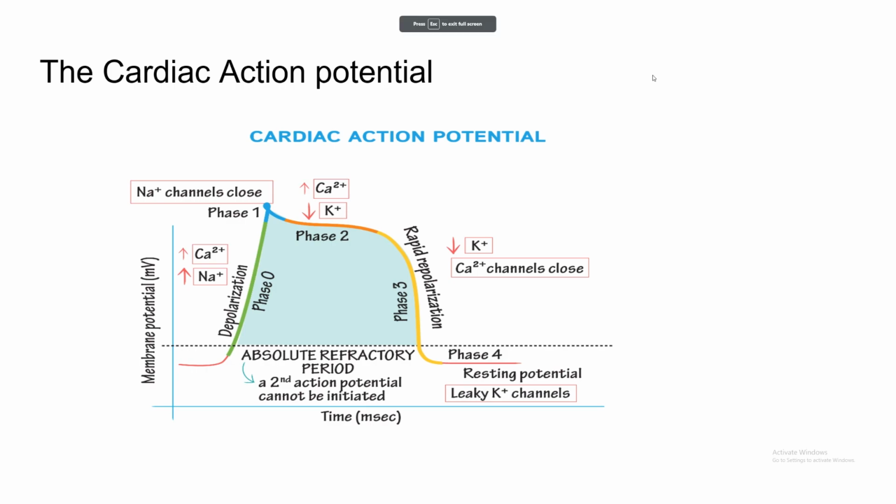And the importance of what I just talked about in the context of one of our main diagnostic tools, which is the EKG, as far as the relative refractory period and there being a signal transmitted to the cardiac myocyte during this relative refractory period being a bad thing, right? What this means in terms of analyzing this on our EKG is that during repolarization, cells repolarizing, hyperrepolarizing, that is your T wave. That's how we notice that on EKG, is our T wave.